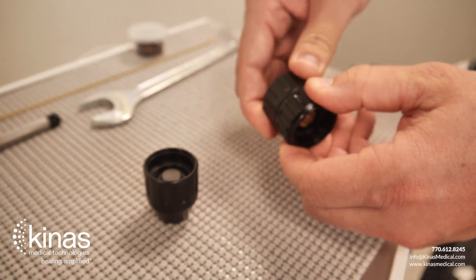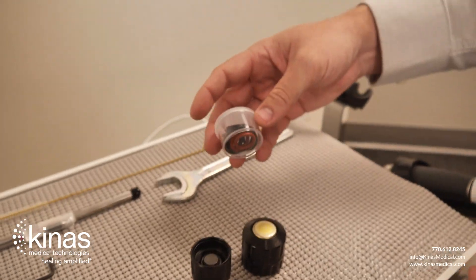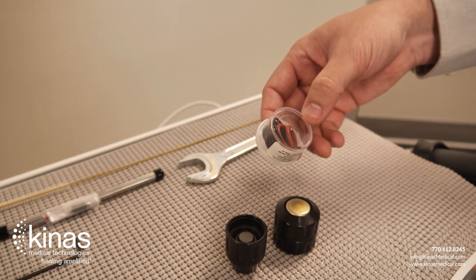If you need any additional O-rings, they have been provided in the original packaging, along with the cleaning brush, Allen key, and in your cleaning kit.